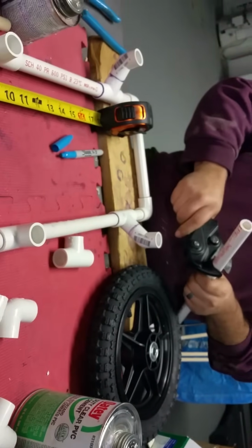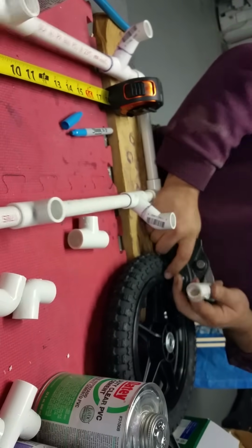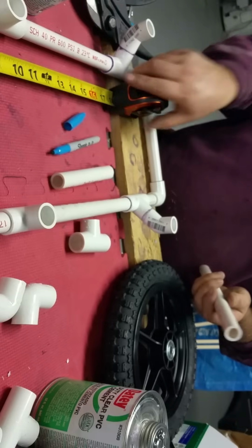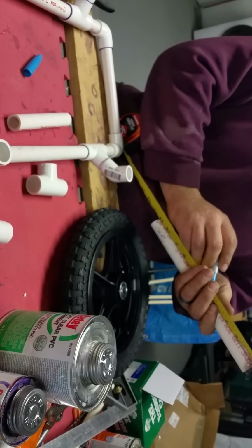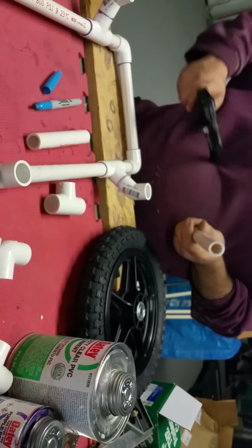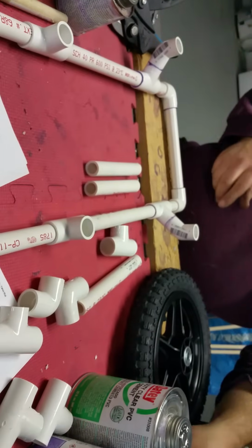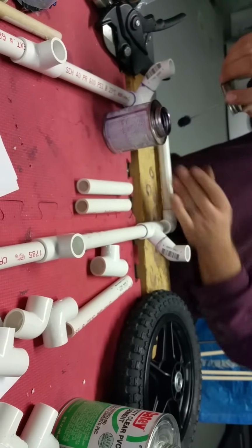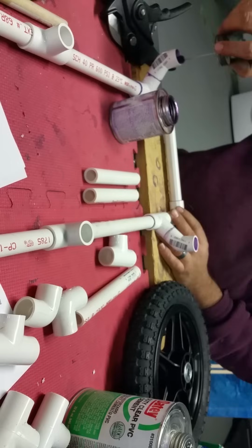So we had said that we were going to, on this bigger cart, use 4 3/4 because that was half of the 9 1/2 that we needed to complete the leg length. We've decided that we're going to round up to 5 inches here because some of that is going to go into engagement into the fitting. This will also give the tube where we're going to be putting the axle bolt through some extra support.